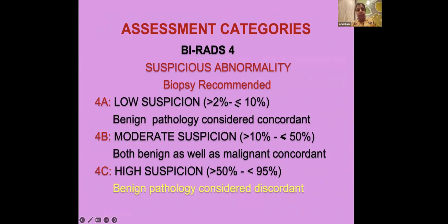The reason or the reasoning behind this is you need to convey to the pathologist and the clinician the degree of suspicion that you have with a particular lesion. And with time, as you practice breast ultrasound, you will understand what to give it.